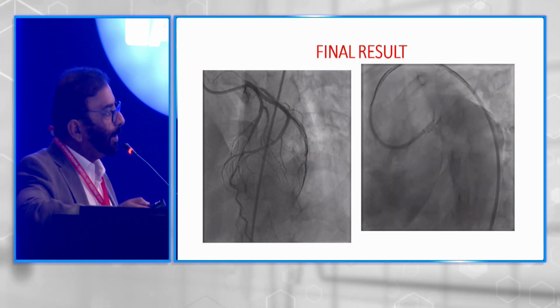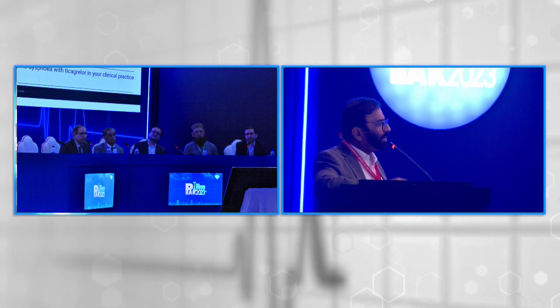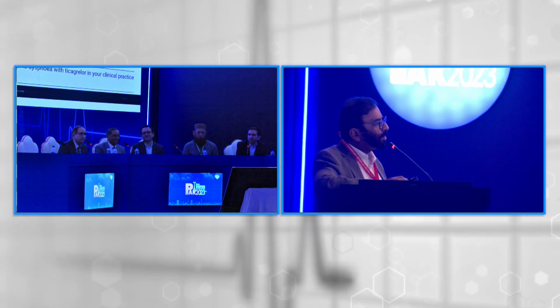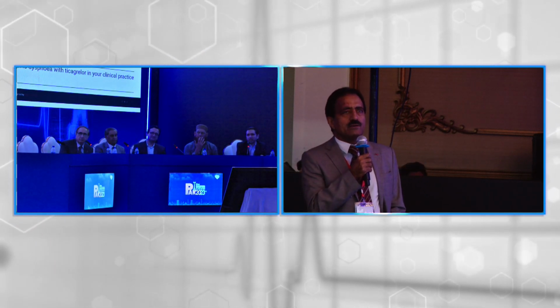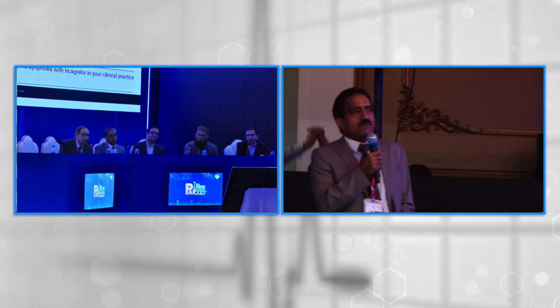Would it have been better if you could do a kissing over there with the ramus? By kissing, you mean a V-stenting sort of situation, it's not very applicable. You can see it's between the circ and ramus, an angle of about 90 degrees. For a pinched side branch, it's very focal. I wouldn't really do the balloon, because doing the balloon in that area, you are causing injury and resulting in restenosis in the future. I think if you do FFR, it may well be negative.